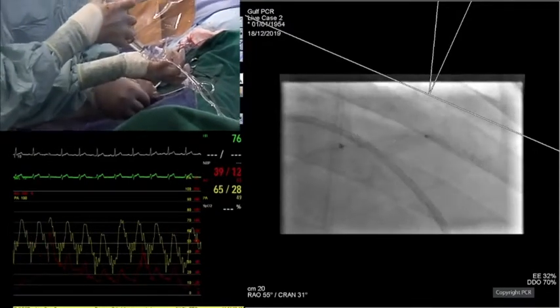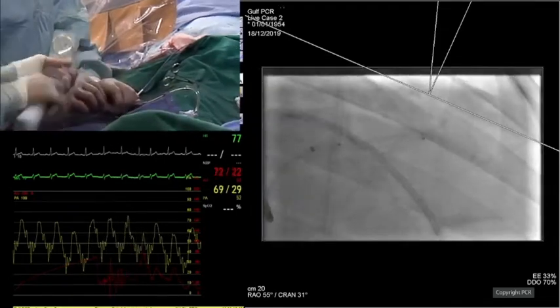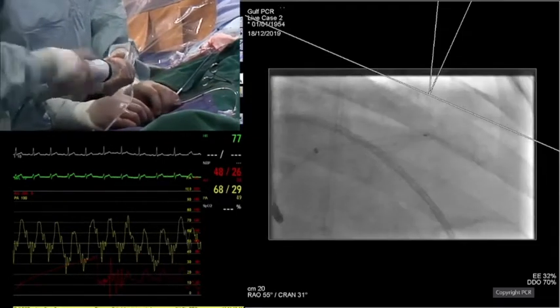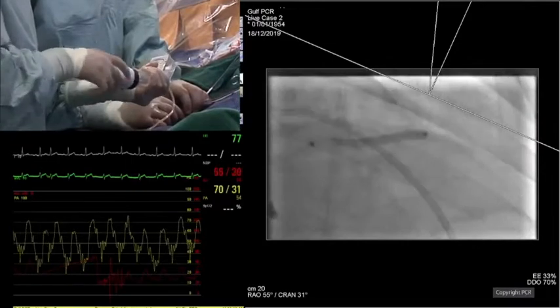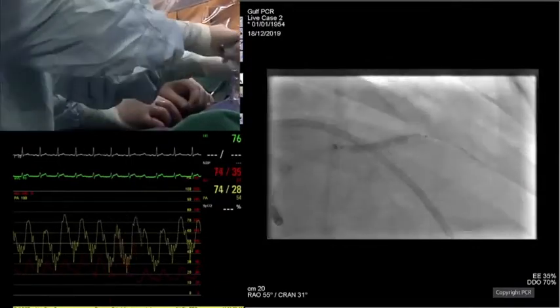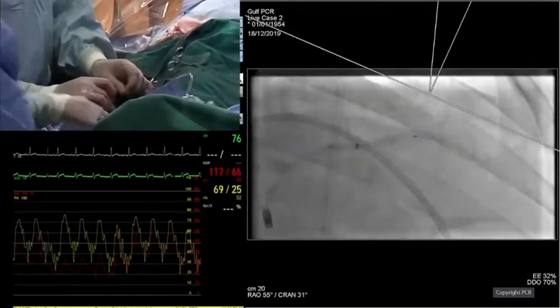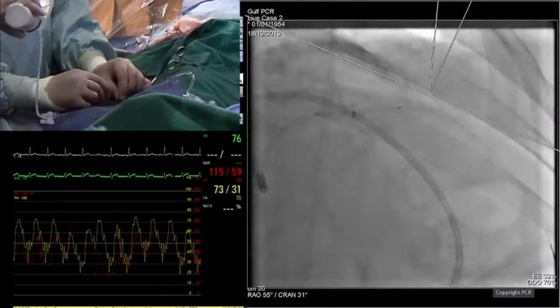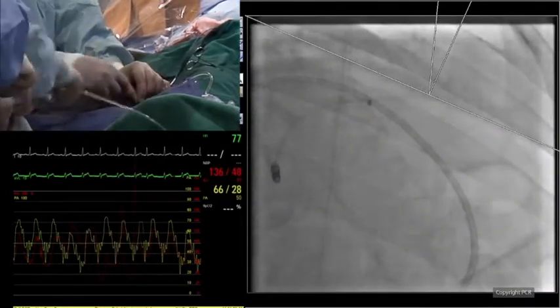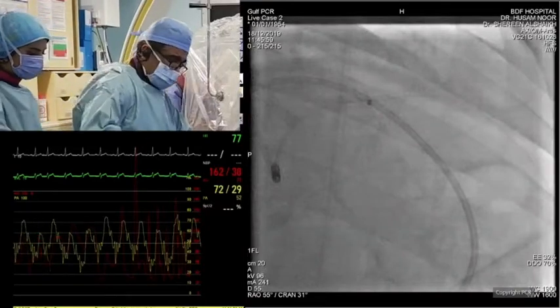I just want to comment, I think it's very important to monitor the right-sided hemodynamics. This is a lost art in cardiology these days, but this is a critical example of how important it is to monitor PA diastolic pressure and anticipate ischemia before it happens, and take precautions, give nitrates, etc. Otherwise, patients could go to lung edema before you feel it, with this LV dysfunction. So I think it's a great idea to have PA monitoring.